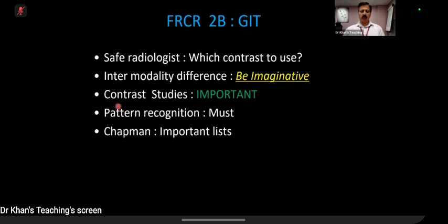Now, contrast studies, as in bariums, are important for the exam. Why I say important is that your chances of getting a contrast study, I'm not saying all of you will get one, but you might get a contrast study. I know that the current generation doesn't have experience.